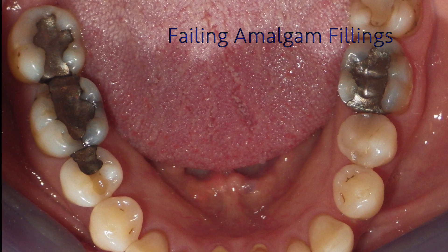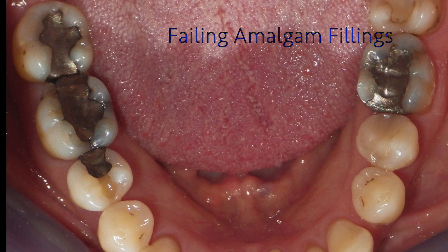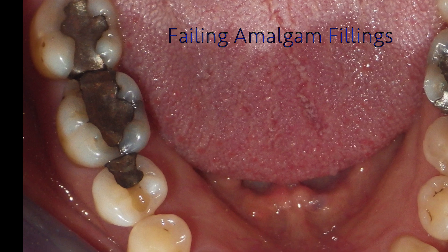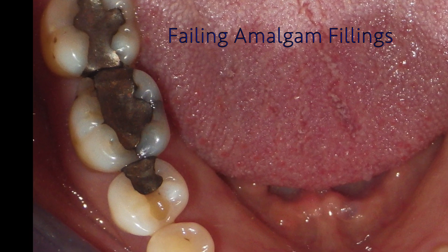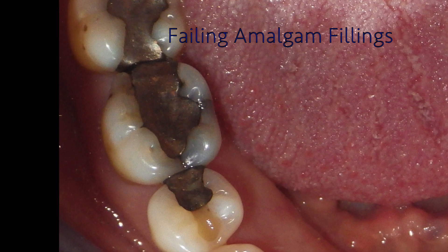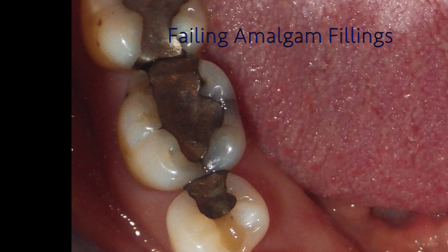In this case we can see fillings that are failing. The seal has broken down between the filling and the tooth, and decay is now growing underneath the filling. We can also see several cracks in the molar. We'll show you step by step how we remove these fillings and clean the decay out from under them.